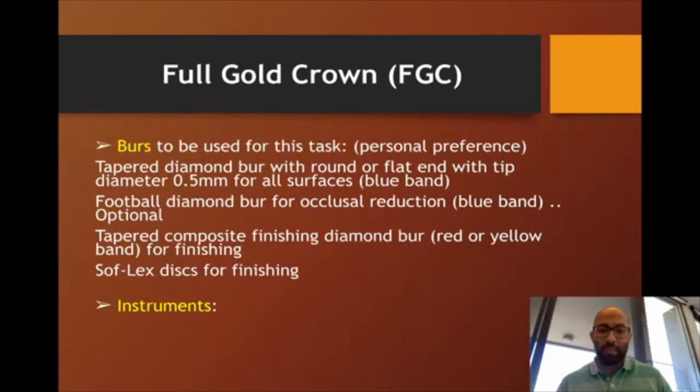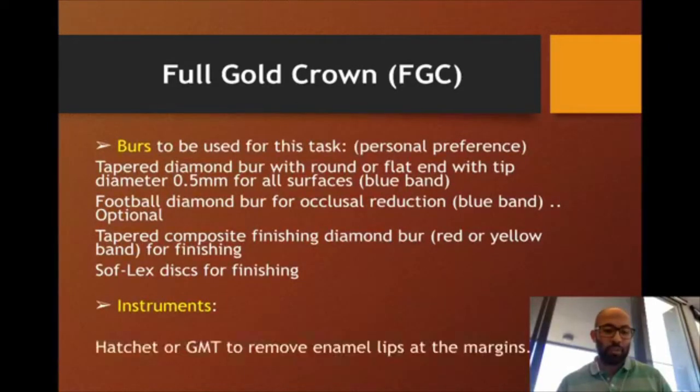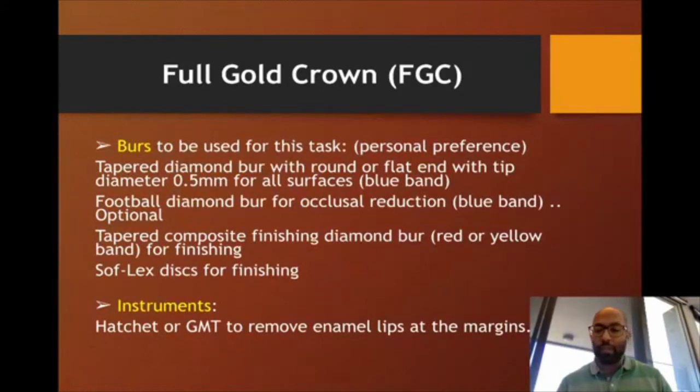Instruments that can be used on this task as well are the hatchet or the GMT, gingival marginal trimmer, to remove enamel lips at the margins. But this is also optional. It also depends on the accessibility of the tooth.